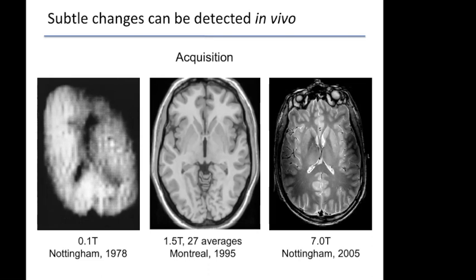or even where the CSF sulcal spaces reside, to what you have here in the middle, where you have this really elegant differentiation between gray matter structures on the cerebral cortex. You can make out the cortical ribbon very beautifully. Subcortically, you start seeing the striatum, the thalamus, the pallidum, and you can differentiate that against the surrounding white matter, which is very useful.